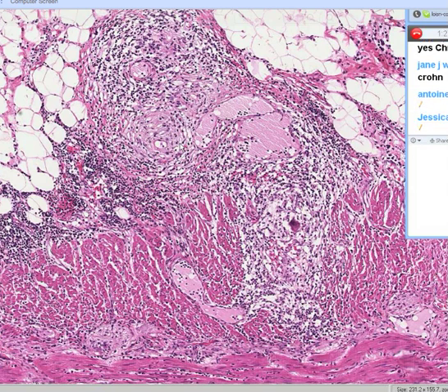And the reason is because remember, in ulcerative colitis, you do not get much inflammation in the smooth muscle, and therefore the integrity of the bowel wall stays preserved, even in severe ulcerative colitis. But in Crohn's colitis, you have infiltration of that wall and the smooth muscle with inflammation, and therefore you weaken it. So fistulas are much, much more common in Crohn's colitis rather than ulcerative colitis.